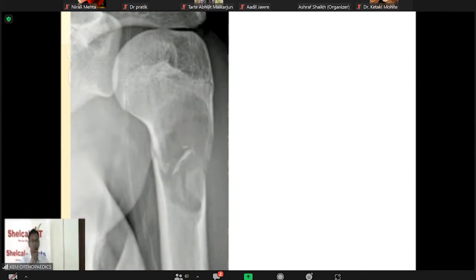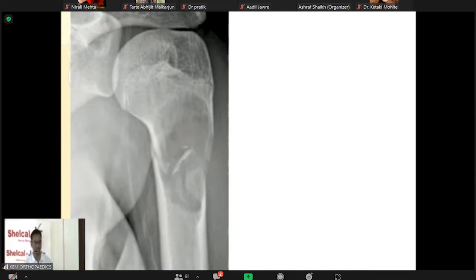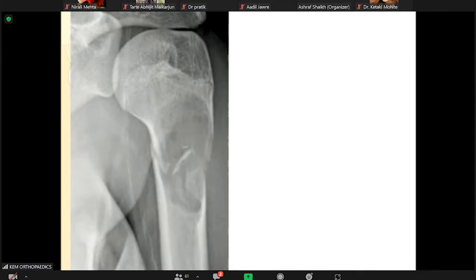Anyone? Chalo. No. I want a little better now. After explaining all this, I should not get an answer. This is UBC. Okay. Anyone? Dr. Ronak? This appears to be a simple bone cyst with a falling leaf sign. You can imagine that I'm your examiner. You're giving your table viva. Now answer. Appears to be a, and first describe. See, that's what I told you.